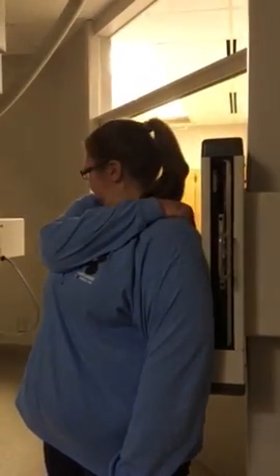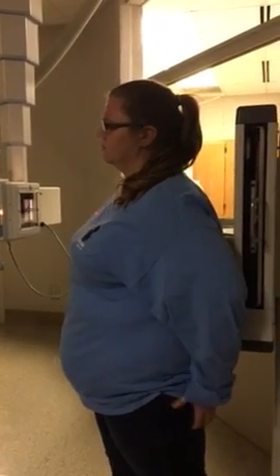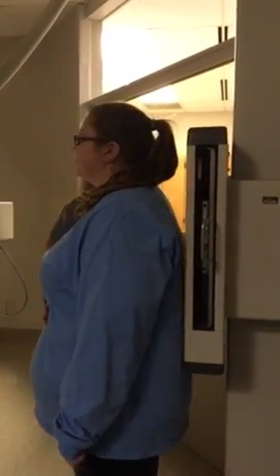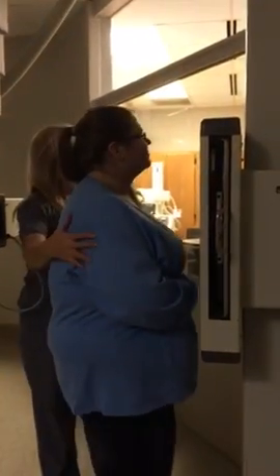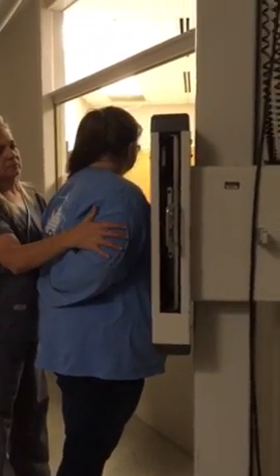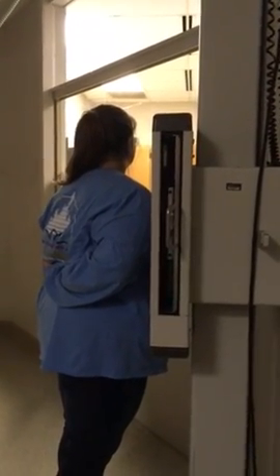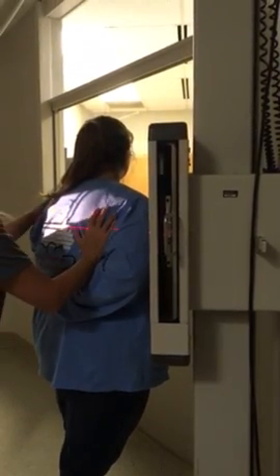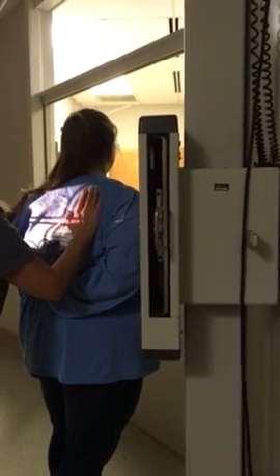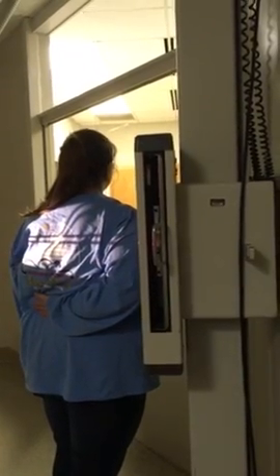Any questions on that? We did AC, we did clavicle, scapula, lateral scapula. Only difference is you've either got to put their hand behind or back. Bring your arm back behind you. We don't roll up enough to put it lateral. I'm sorry, nothing like being manhandled, is it? Okay. To get your lateral.